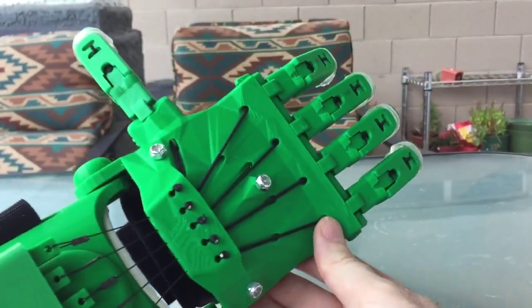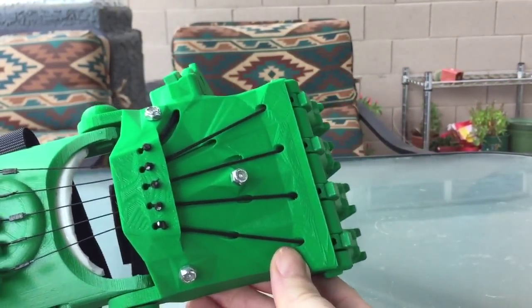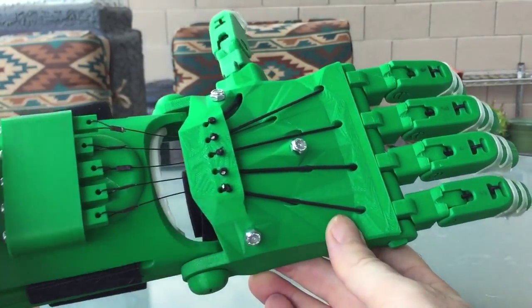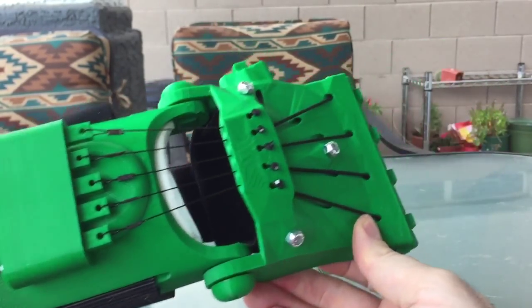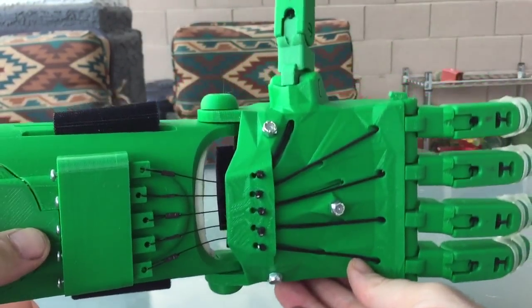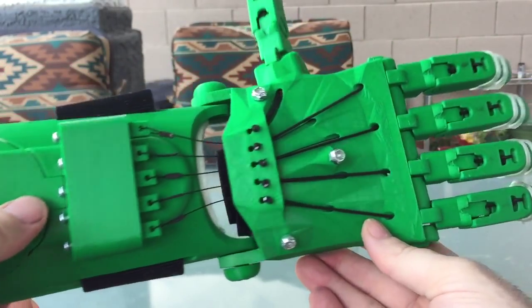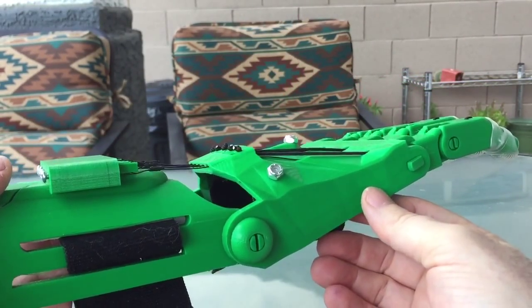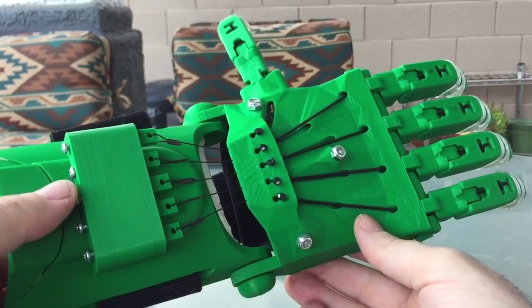So now when you close it, the action's real nice. I think these cables are going to be a lot stronger for the person wearing the hand and easier to adjust. So that's a finished Raptor prosthetic hand, printed on a Delta 3D printer — a Delta Maker. We're ready to send this off to Enable and then we'll get some of these out to kids and other people that need some.